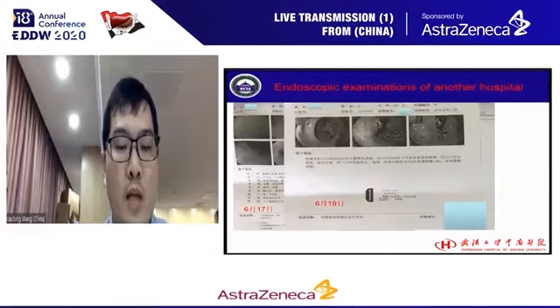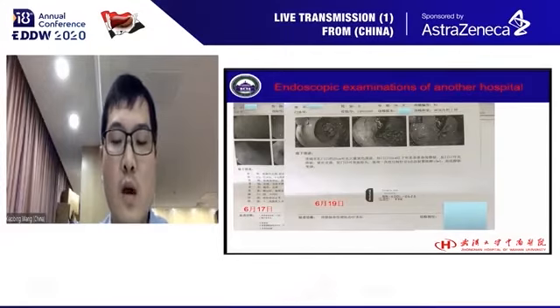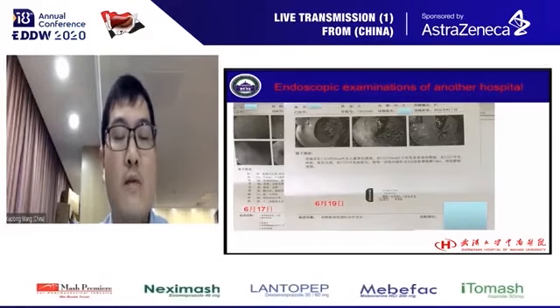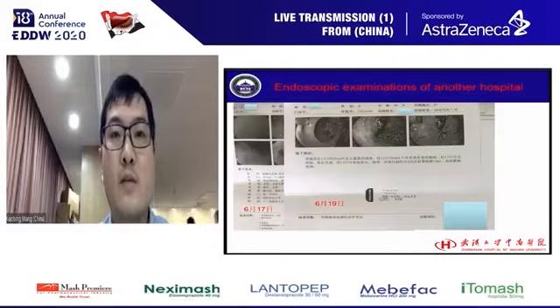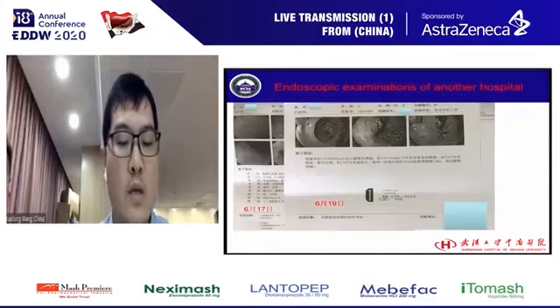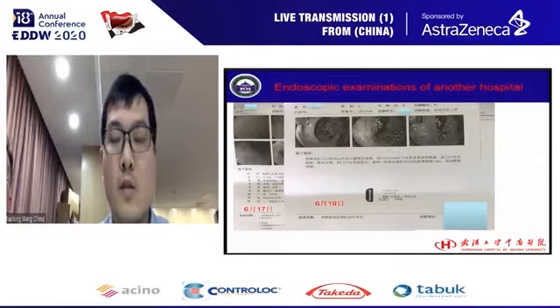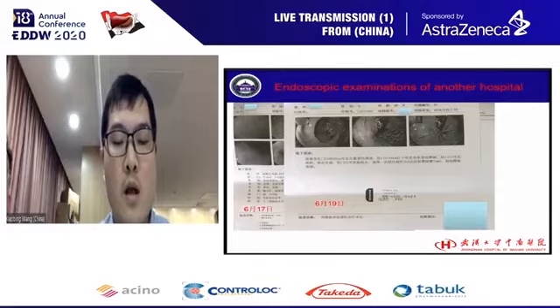On June 19th, the patient received her first colonoscopy, and rectal varices were found less than 10 centimeters from the anus. Hemorrhoids node with thrombus was obvious, which communicated with rectal varices. Endoscopic sclerotherapy was performed using 10 milliliters of lauromacrogel, injecting into 3 points.